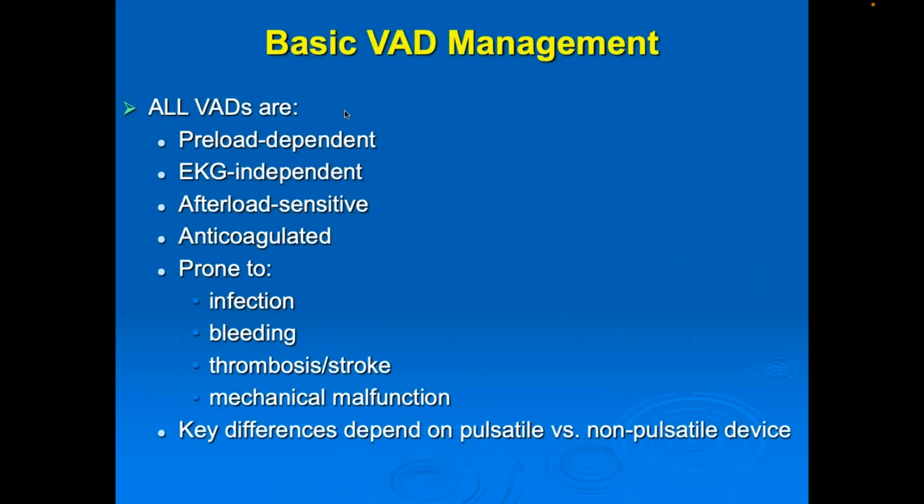So, basic VAD management. Remember that all VADs are preload dependent, so the amount of fluid coming in matters. They are EKG independent, and they are afterload sensitive. They will be anticoagulated, so you're going to need to look for patients that are on blood thinners. But they are also prone to infection, bleeding, thrombosis, stroke, and mechanical malfunction.